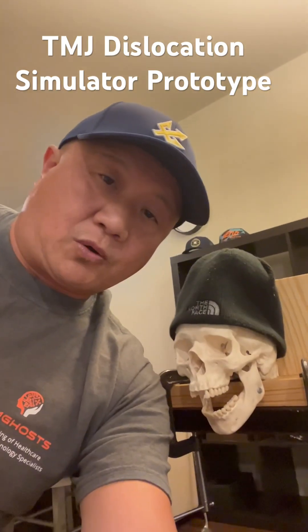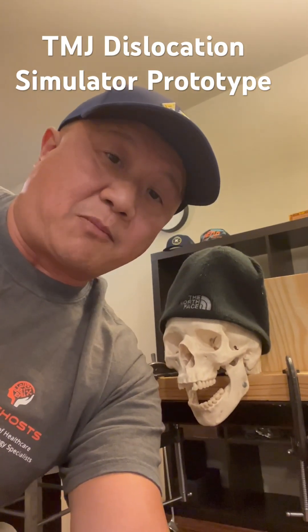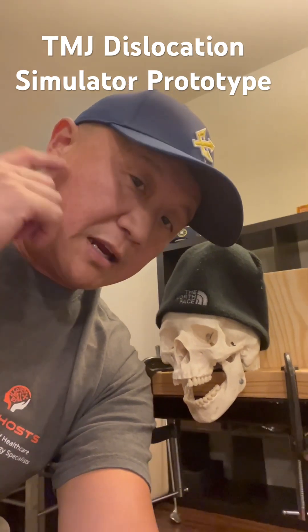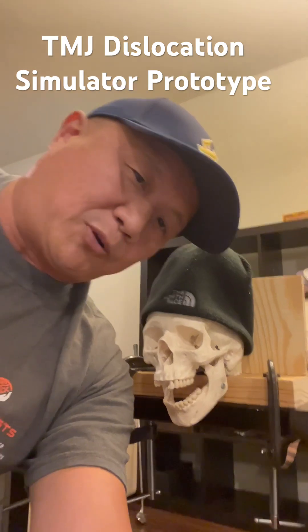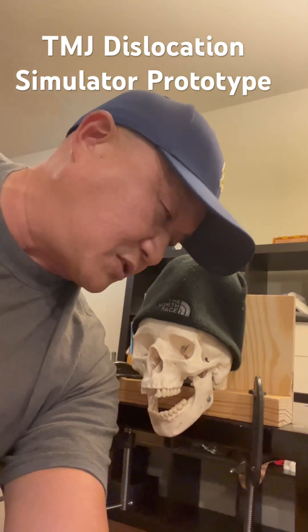Hey, how are you doing? This is Doug from MM Medical. This time I'm going to demonstrate how to reduce TMJ dislocation. So this is my prototype TMJ Dislocation Simulator.